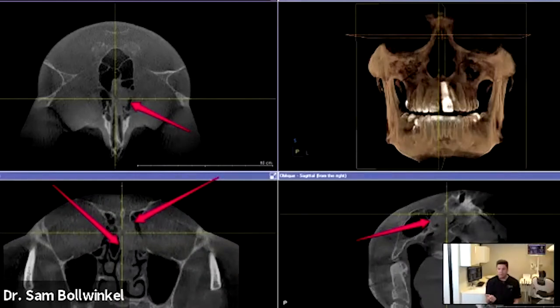The unique piece with this is this patient came in and he said, you know, I've got this implant up here and the front of my face just kind of hurts, around my nose, my tooth. Is it the implant? Well, in years past, I've taken an X-ray. The implant was placed by my specialist. I would take an X-ray, refer him back to my specialist. He would have taken some X-rays, and we'd be going, yeah, everything's fine. Until it gets worse, we're going to let it go.